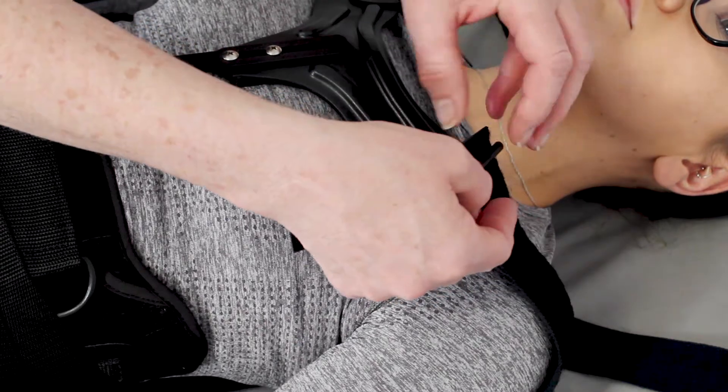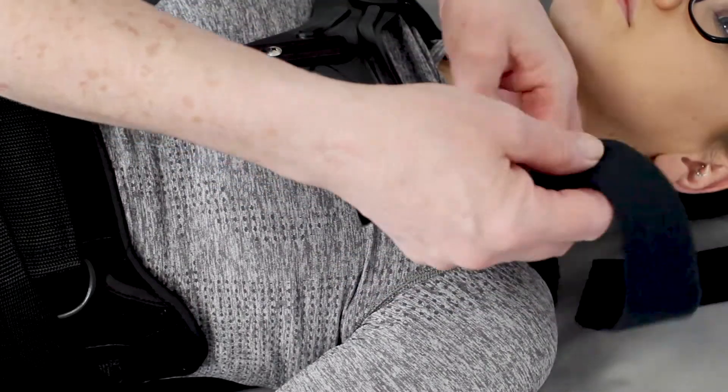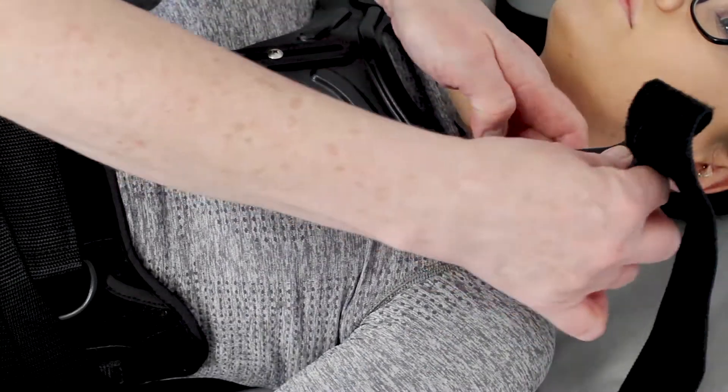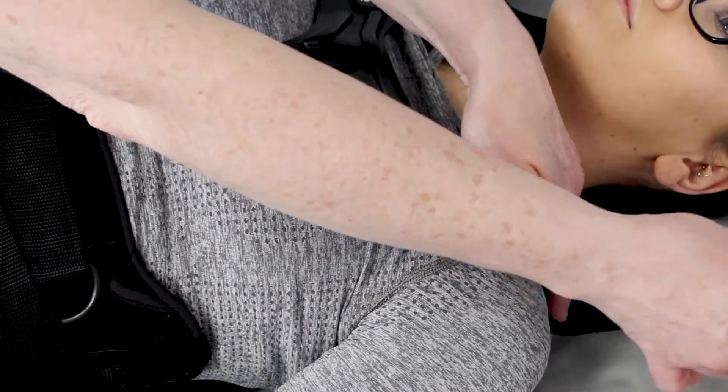If the brace requires a PTE, bring the padded straps over the patient's shoulders and back under the arms, log rolling the patient if needed. Cross the straps behind the back and bring them around the front of the brace and secure with the buckle.